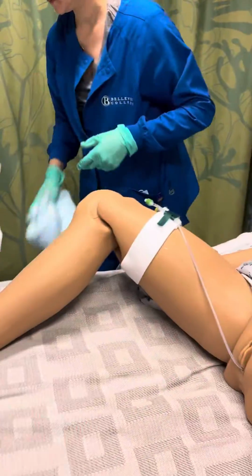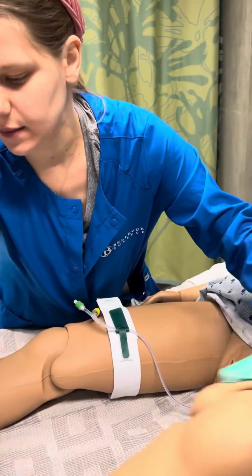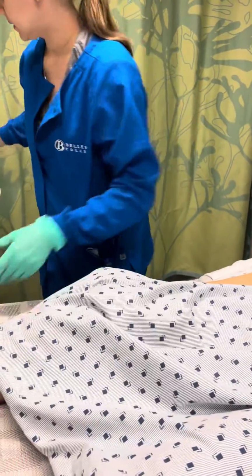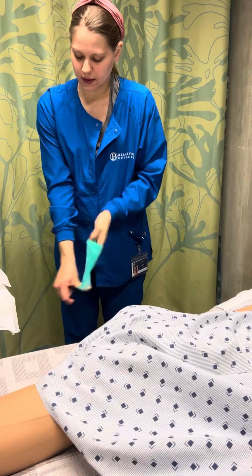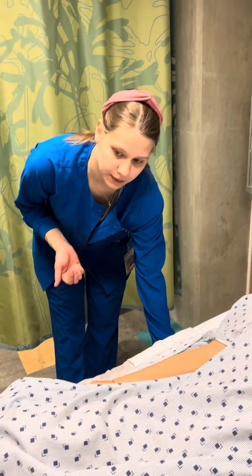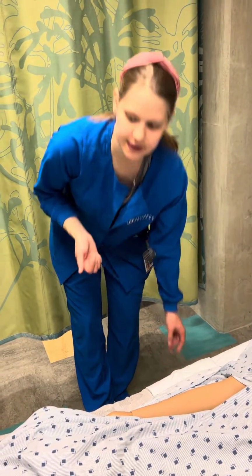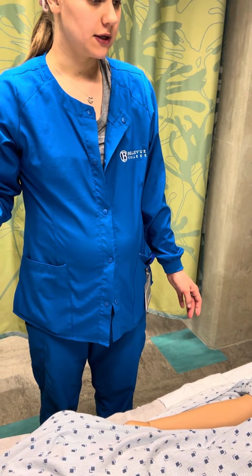Remove the drape. And reposition my patient so that she's comfortable and provide privacy. Cover her up. Remove all of my supplies. Remove my non-sterile gloves. I'd bring the patient's bed back down, give her her call light, anything she might need, and I would document the type of catheter I put in and the French size. And if I had a urine sample, I would submit that and document the patient's tolerance for the procedure, and then perform hand hygiene and leave.